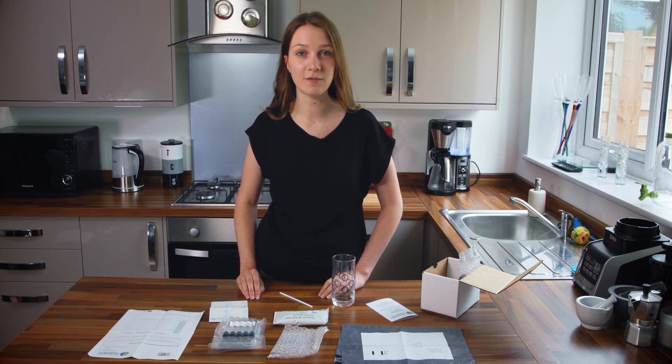Once you have taken your tenth and final sample, you may resume your normal diet and activity. The test will take two hours and 15 minutes in total. Make sure all your completed tubes are in their bubble wrap pouches and sealed. Place these tubes back inside the test box along with your symptom sheet, and place this box inside the plastic envelope and seal. Drop this parcel off at your nearest post office within two weeks so it can be delivered back to our lab.